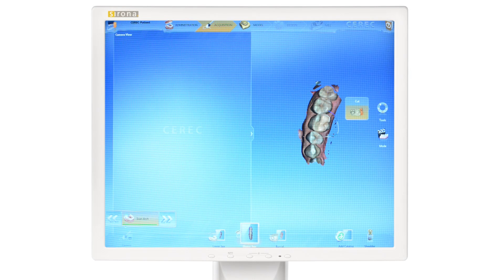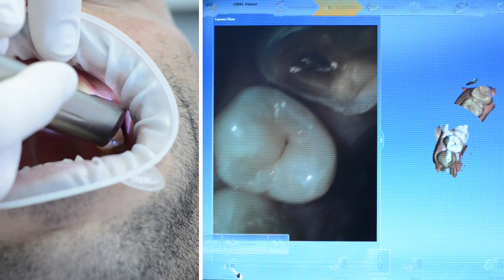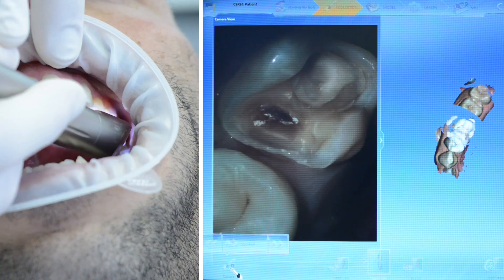With OmniCam, the model captured before the preparation can be altered by removing the original tooth with the cut tool. The prepped tooth is then scanned and automatically added to the existing model.